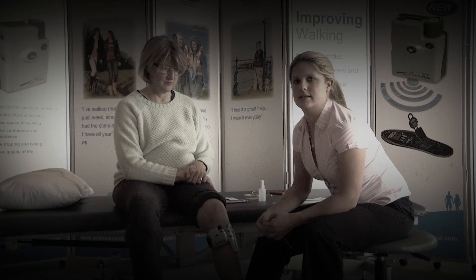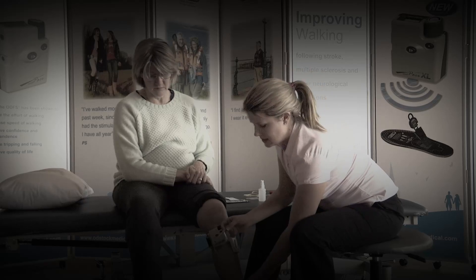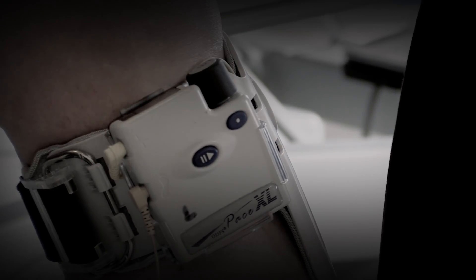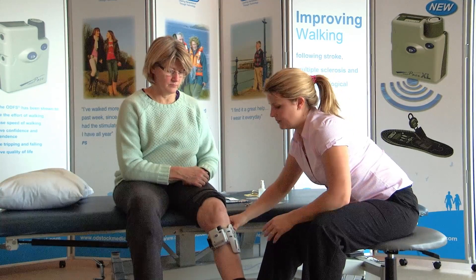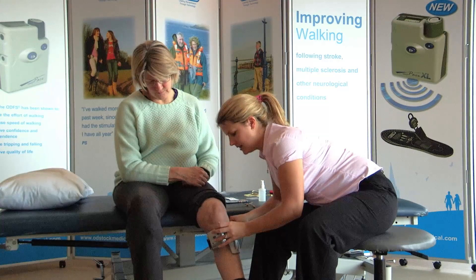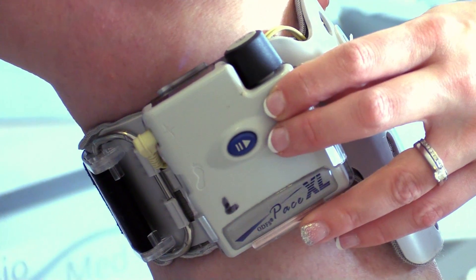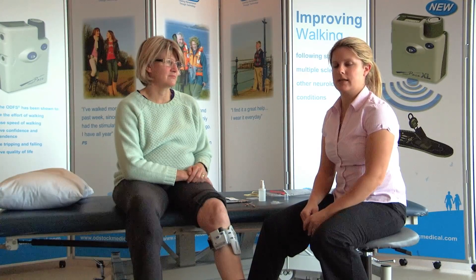On this occasion we have a wireless system, but if you have a wired foot switch, then prior to the patient walking you need to connect up the foot switch lead and insert it into the foot switch socket. Once you're happy with placement, turn on the Pace if it isn't already, check it's turned up to the correct intensity, and press the test button. Once you're happy with the response in sitting, test it in walking to confirm you still get an adequate response, and adjust accordingly.